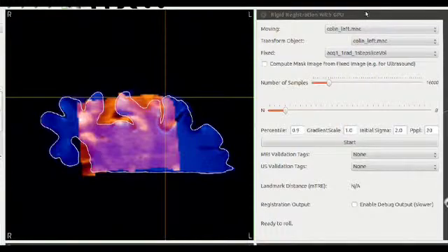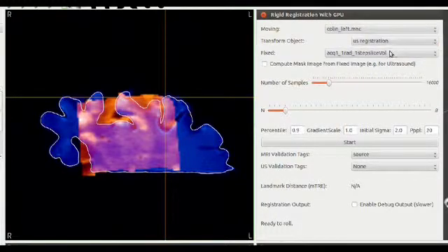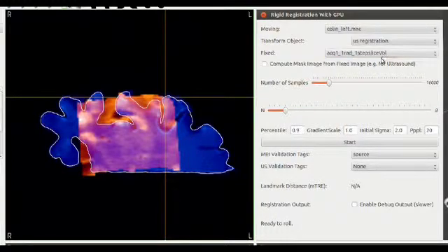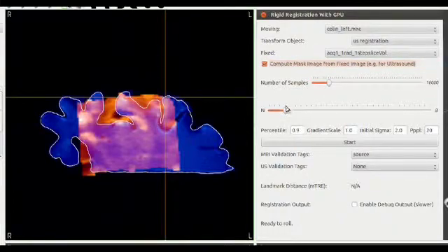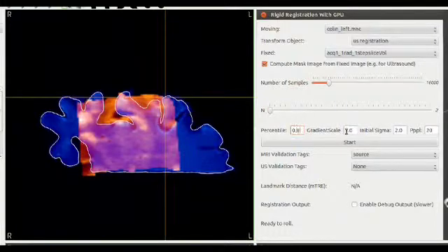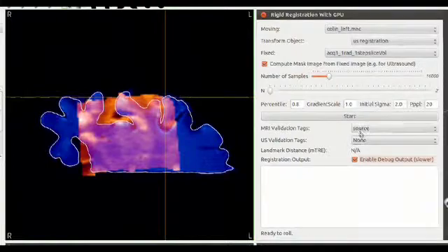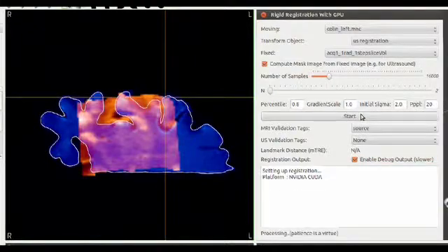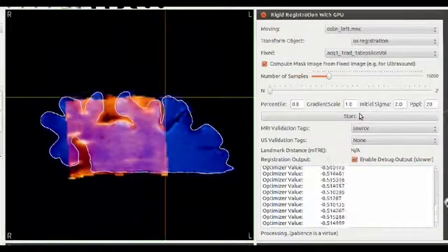Using a registration algorithm based on gradient orientation alignment, we can register the preoperative images to the intraoperative images to accurately portray the surgical reality of the patient being operated on. Our moving object is always our preoperative image and our fixed object is our intraoperative ultrasound image.